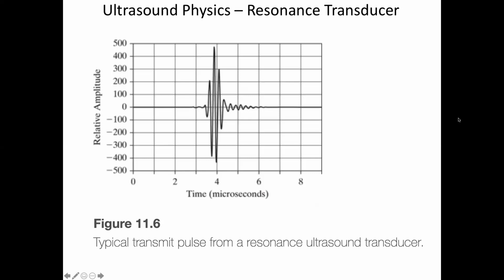So say we had the therapeutic device at 1 megahertz and the diagnostic one at 3 megahertz. So they're outside each other's bandwidth. You would imagine you would see something. I don't know if that's true. That's something to look up. You could probably Google that and figure that out.